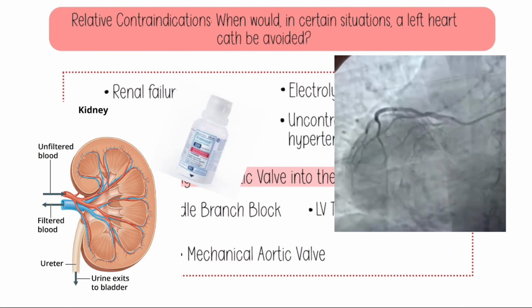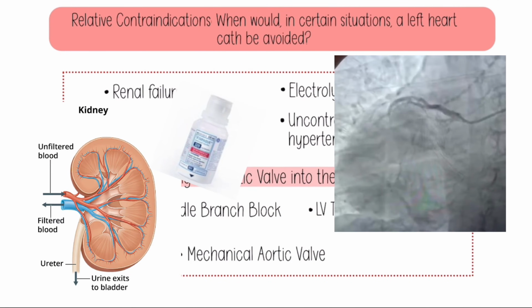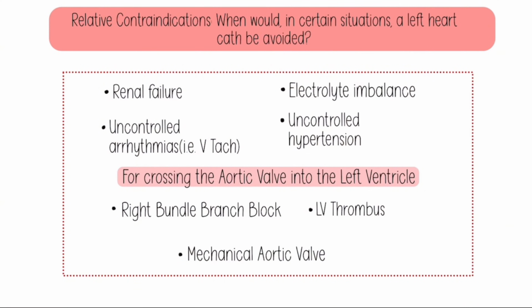Some physicians like to hydrate their patients before, either because they do have renal disease or just as a preventative. And there is a hydration protocol after as well to make sure that that filters through. But if someone has end-stage renal disease, they're not on dialysis yet, they might not want to take the risk of giving them additional contrast that would push them over that edge if they're not 100% this procedure is going to benefit them.